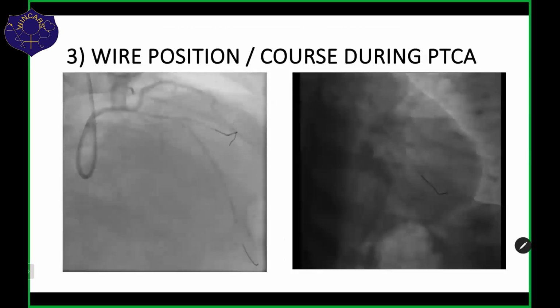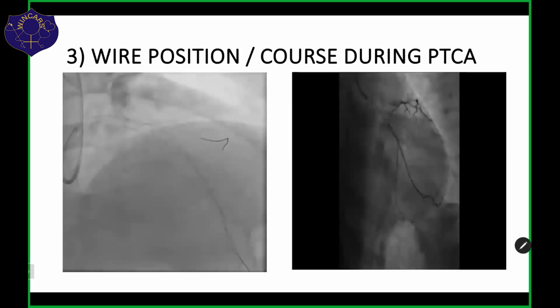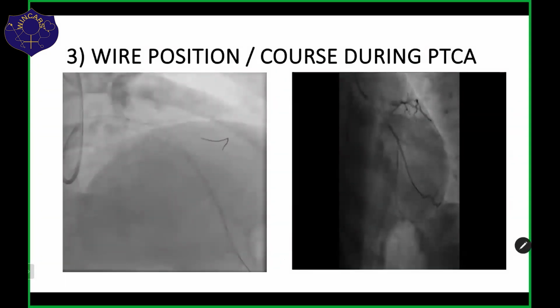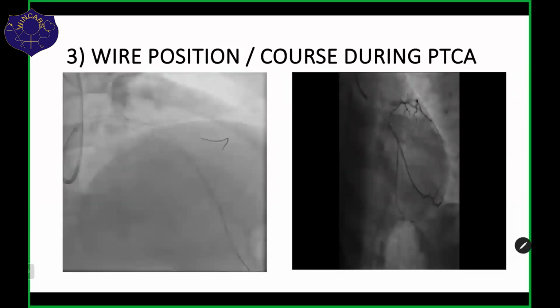So this is an angiogram, because the angiogram is part of angioplasty, where the patient was taken up for angioplasty, and what we realized was something funny was happening with the lie of the guide wire. Can you please tell what's happening here, Deepak? Sir, we can see in between the guide wire and this vessel a faint dissection-like thing, sir, a radiolucent spiral.